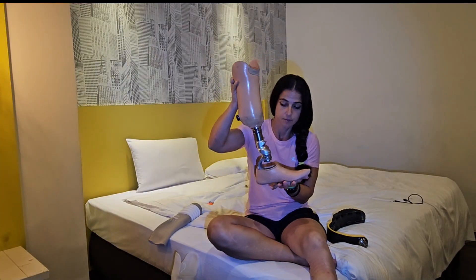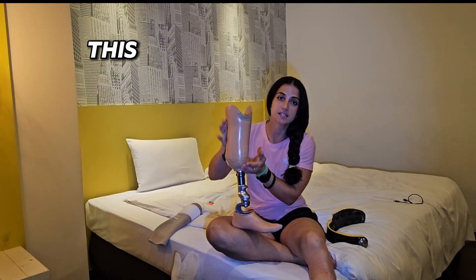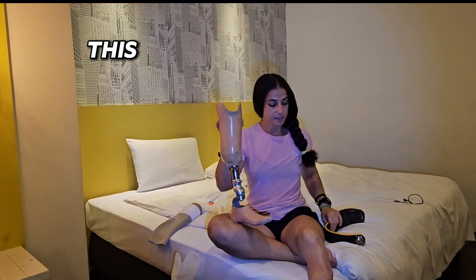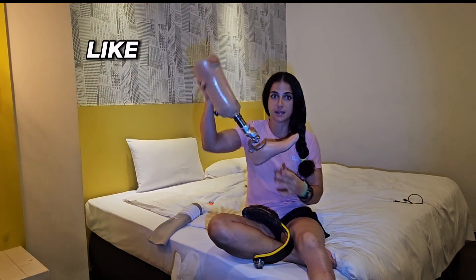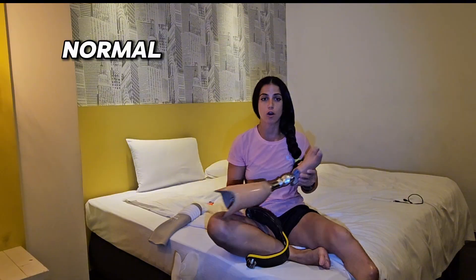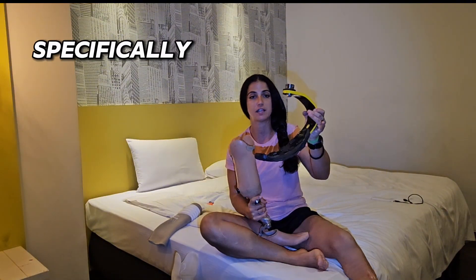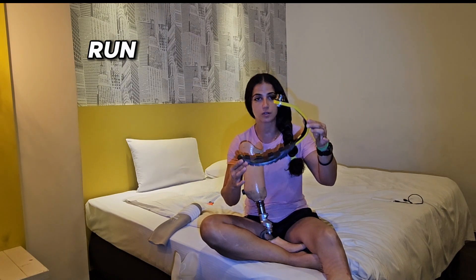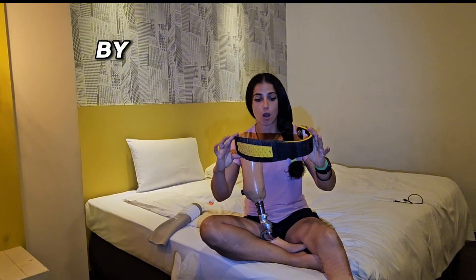Let's start from this leg. This is a leg with a foot — this is a socket and this is a foot. This is only a foot itself. I know it doesn't look like a normal foot with toes, because this is specifically for running and jumping. You only want to run and jump with this one. This is a Flex Run by Össur.